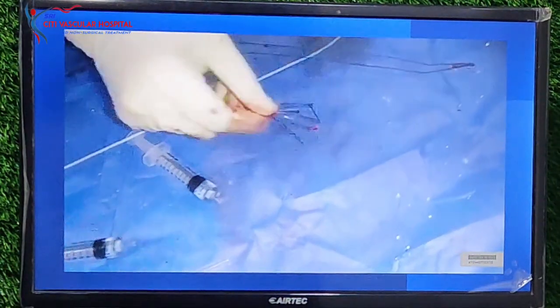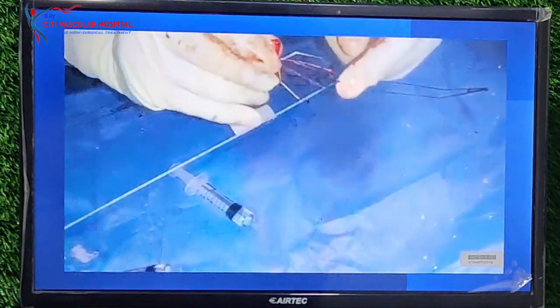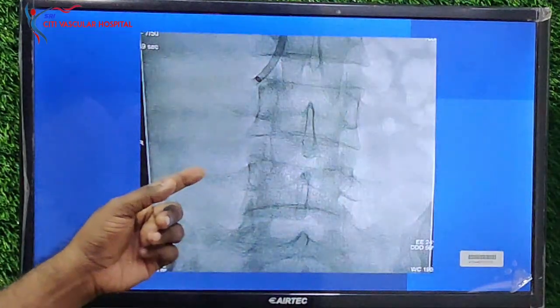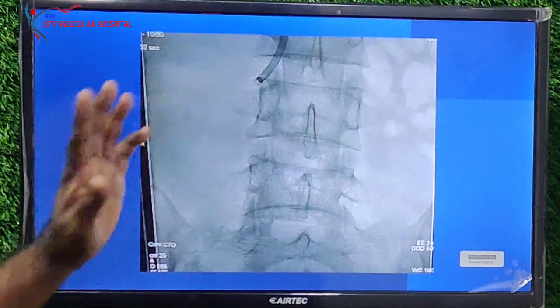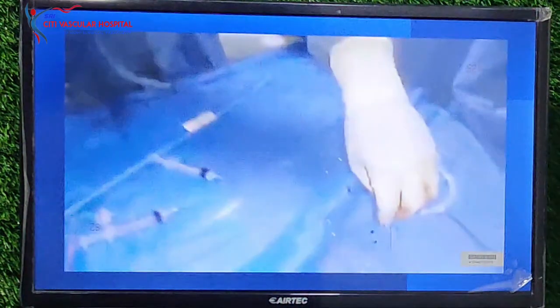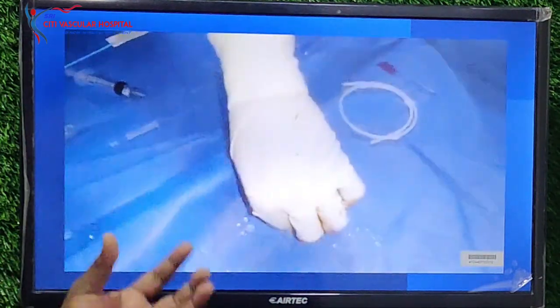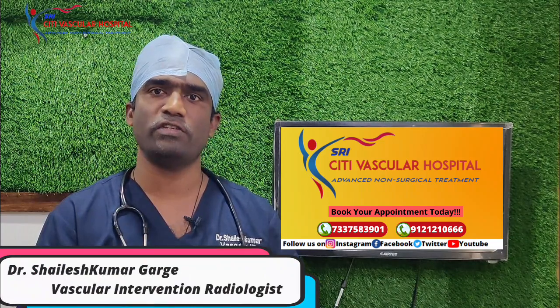You can see there are very few clots because the DVT has completely cleared. We are checking the IVC filter to confirm that there are no struts or limbs remaining. This is the final run to check whether there is any leak or oozing of contrast. And this is how a successful removal of the IVC filter is done.